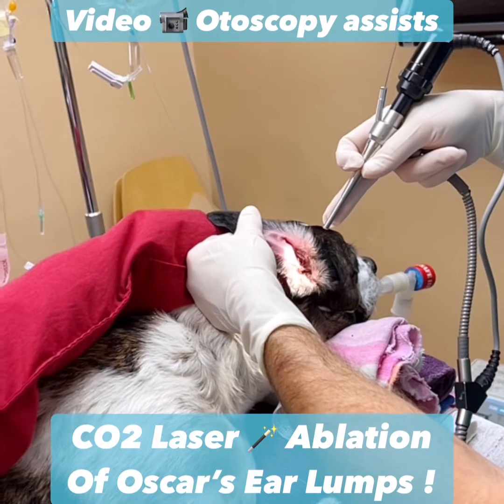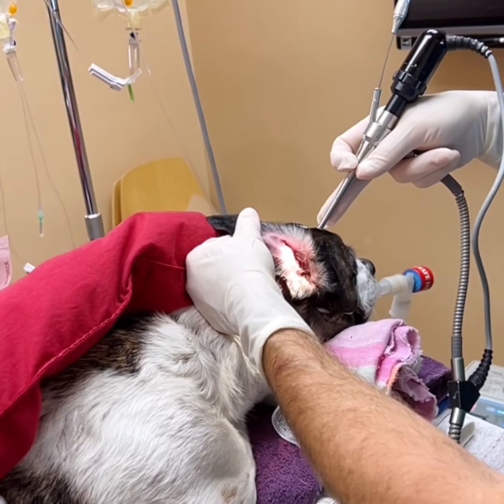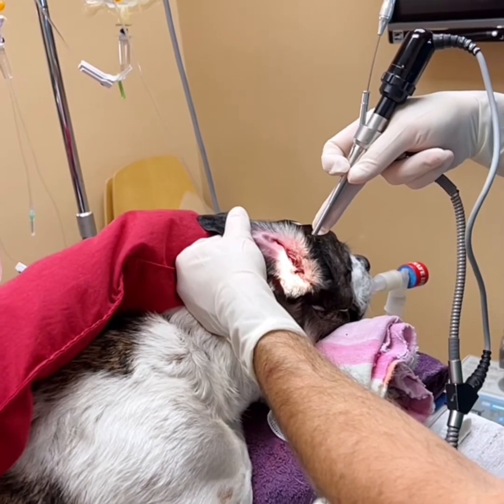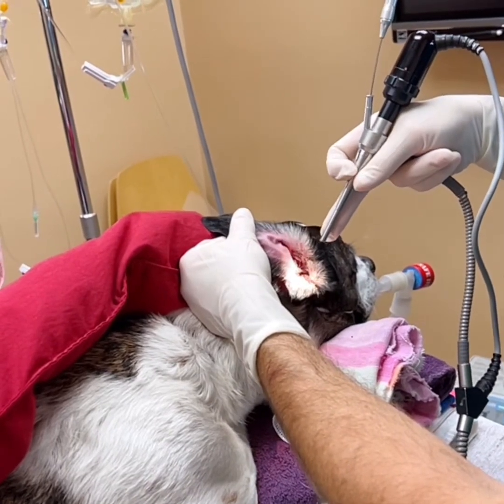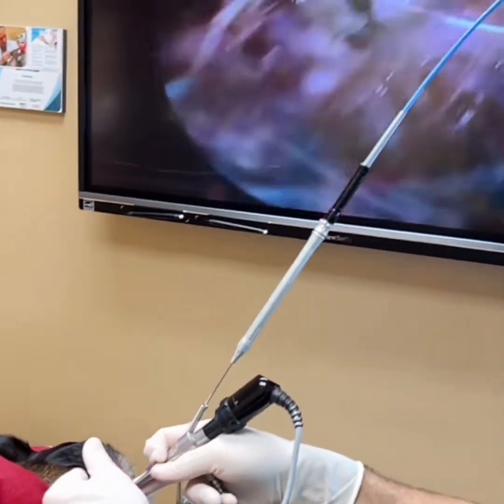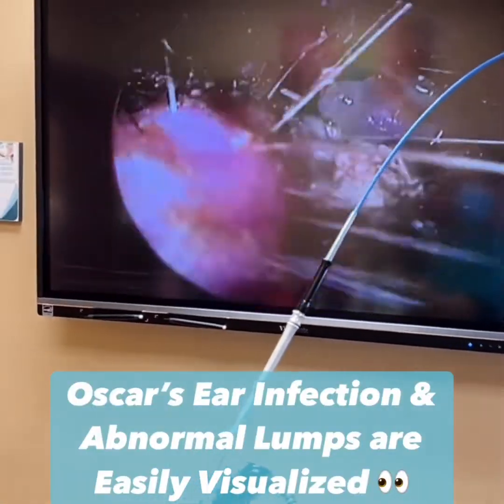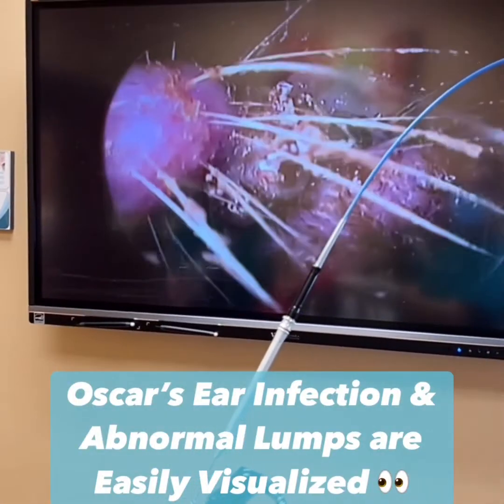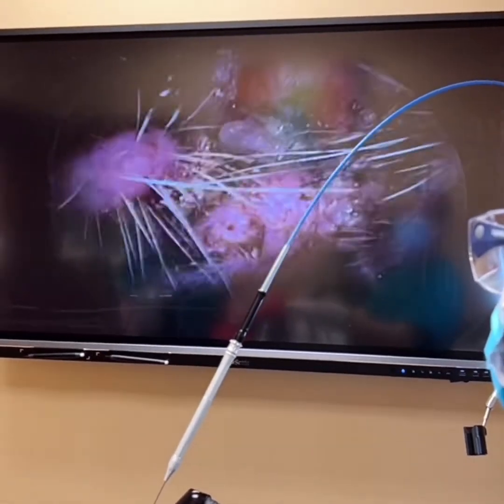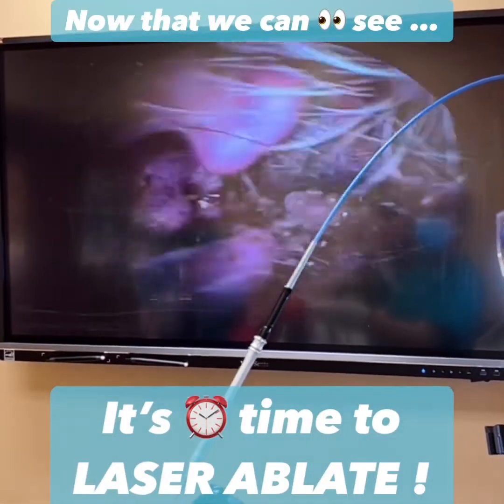Here you can see the setup of our video otoscope attached to our surgical laser. This is going to allow us to see the screen, and it's going to show us what we're dealing with. Here you can see the infection in the ear canal, and we're going to go ahead and remove the first lump with the laser in just a second.